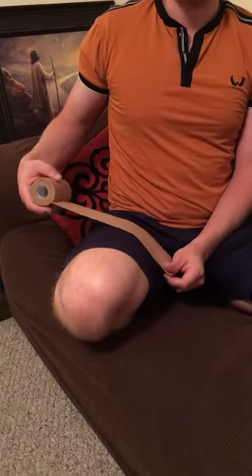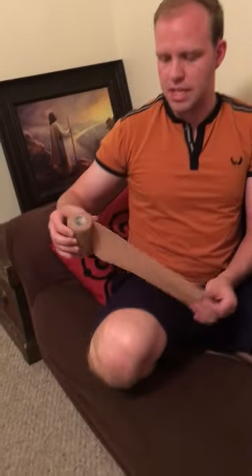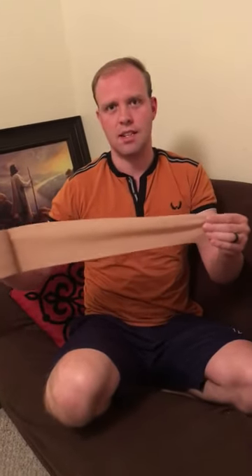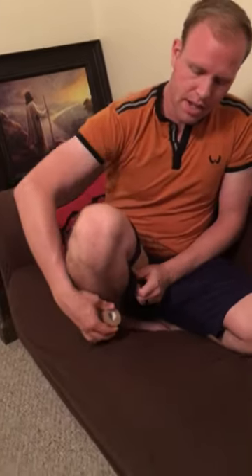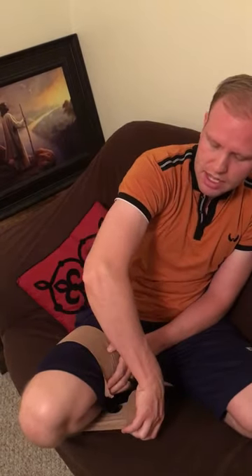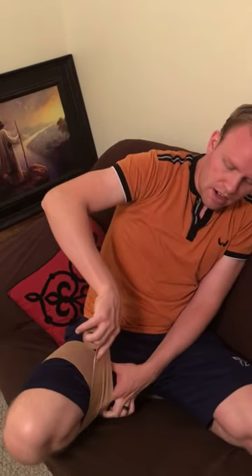I am wrapping a stump. I couldn't get an ace bandage so I got the elastic one from last time, but let's just pretend this is an ace bandage. We're going to anchor it and we're not really going to be applying much pressure. I'm going to be pulling this a little bit tight just because I don't know how long this is, but normally I really wouldn't pull it very tight at all.